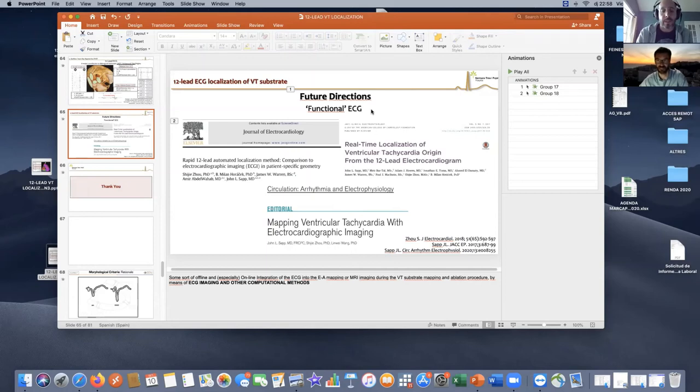And I've always thought, and with some evidence, there are some anecdotal reports, case reports and small case series looking at the predictive value of QRS fractionation to predict arrhythmic events. The reasoning is that QRS fractionation gives you an indication of substrate for both ischemics and non-ischemics. Do you see this QRS fractionation, fragmentation, however you want to call it, as a potential risk stratifying tool for those patients that we still don't know what to do with? At least in the US, we put a lot of ICDs for primary prevention in non-ischemics, and we know the number needed to treat is 1 in 20, maybe even more.